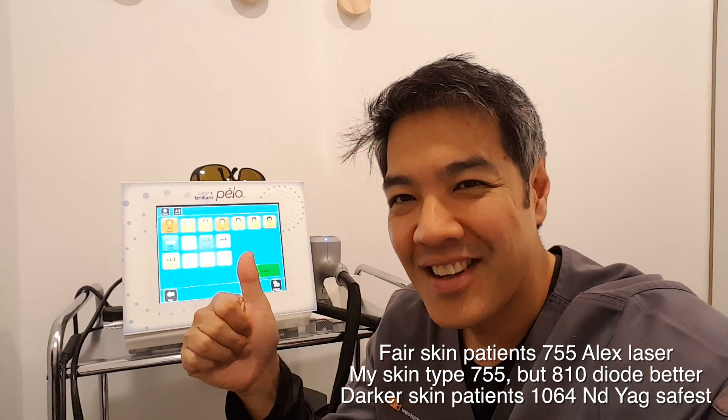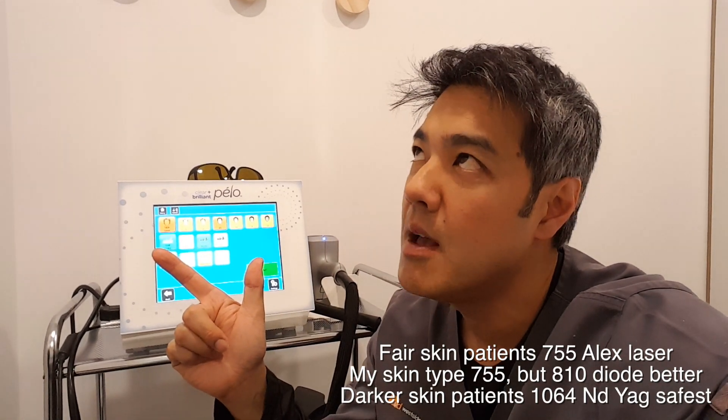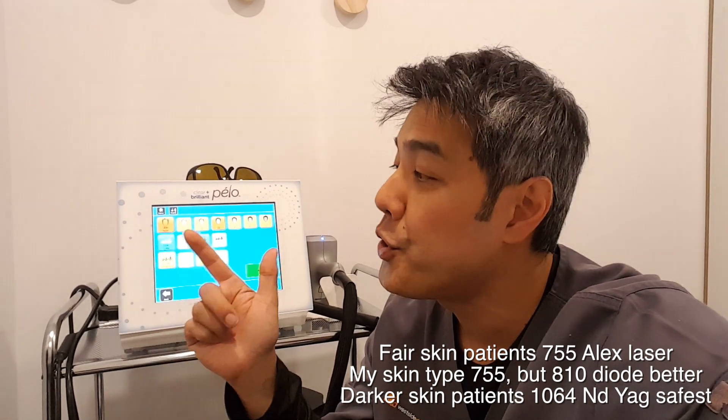I think the key to actually having good hair removal is basically three things. First, we can consider the wavelength. Second, we can consider the cooling system, which incorporates both safety and pain level. And thirdly, and very importantly, is the consistency of delivering that energy. If you can get all three things right, you've got a good hair removal system.